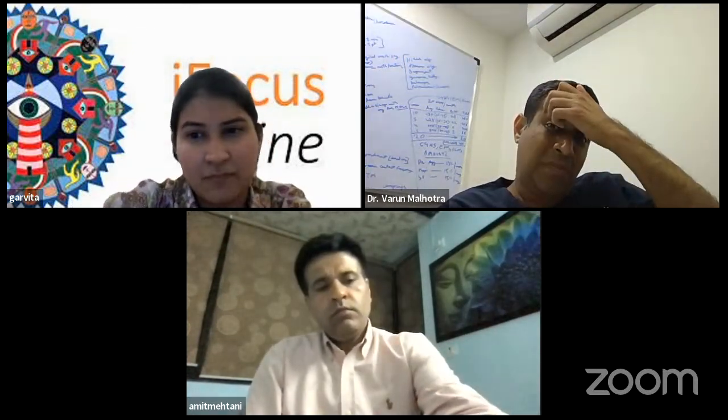Are there any indications, Abhilasha, where you would want to do a surgical PI along with the cataract? I think you have already mentioned in your presentation that PIs are very few and far between now. Mostly I do it in younger patients like kids, because they have a very high chance of getting glaucoma later.